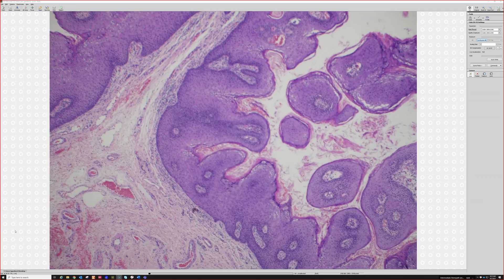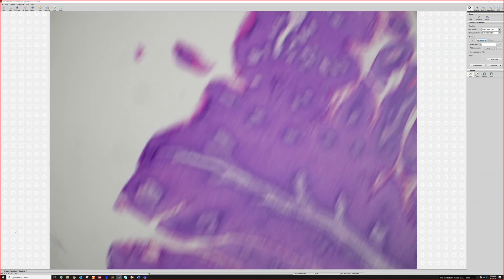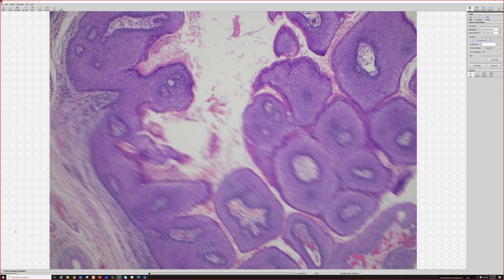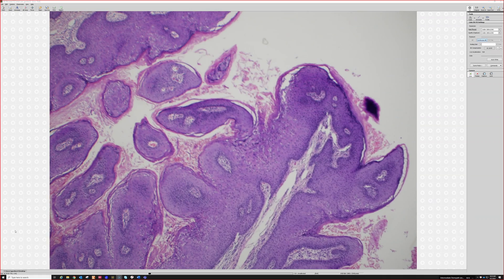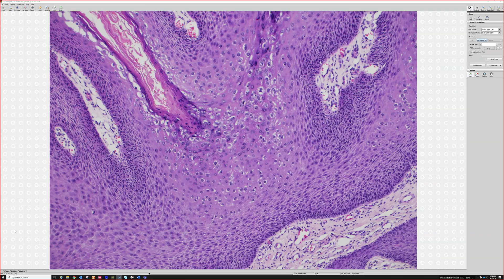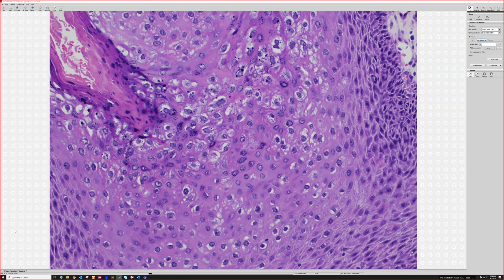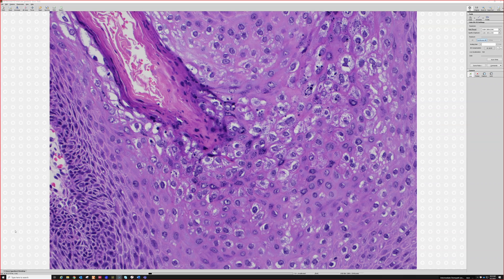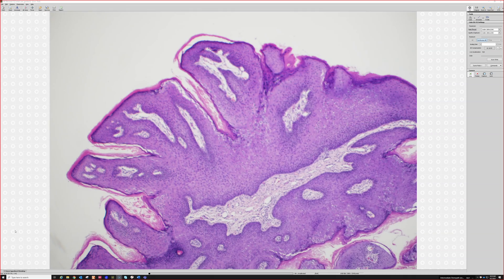Once you confirm condyloma, you always want to look around and make sure there's no high-grade dysplasia — H-CIL (high-grade squamous intraepithelial lesion). If you start seeing really blue, basaloid, atypical areas, that would be worrisome for H-CIL, because H-CIL can arise in the background of condyloma. There are more koilocytes here — consistent with condyloma.